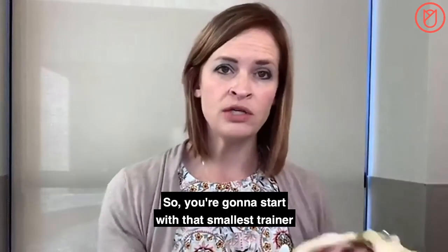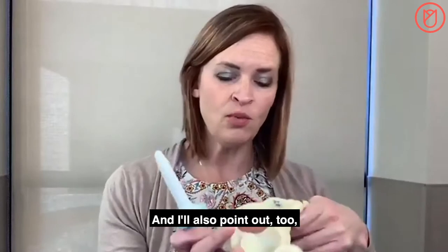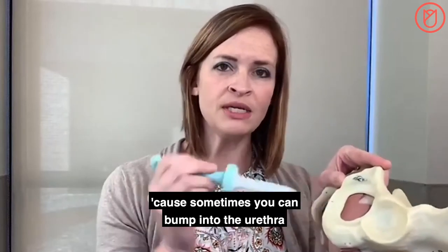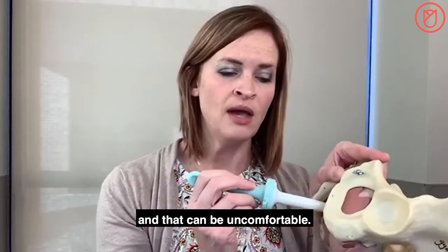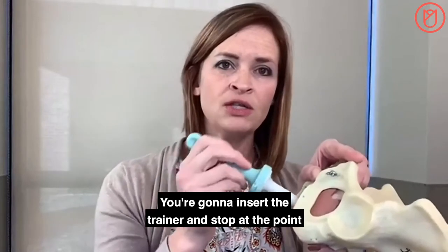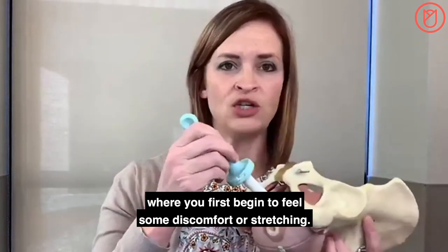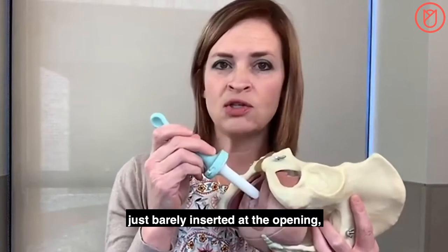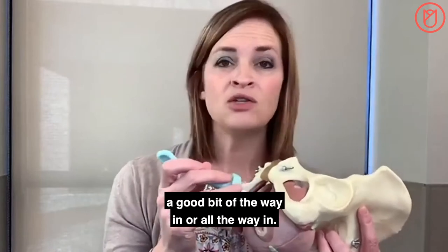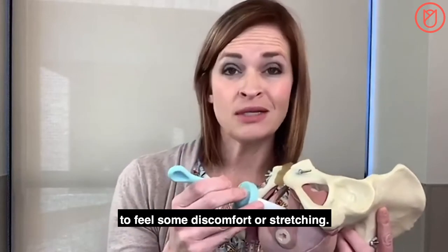You're going to insert the trainer into the vaginal opening. The vagina is angled slightly towards the rectum, so you don't want to go straight in, as you can bump into the urethra, which can be uncomfortable. Angling slightly downward can be helpful. Insert the trainer and stop at the point where you first begin to feel some discomfort or stretching — this might be just barely at the opening, or partway in, or all the way in. There's no goal for how far to insert; just stop at the point where you first feel some discomfort or stretching.